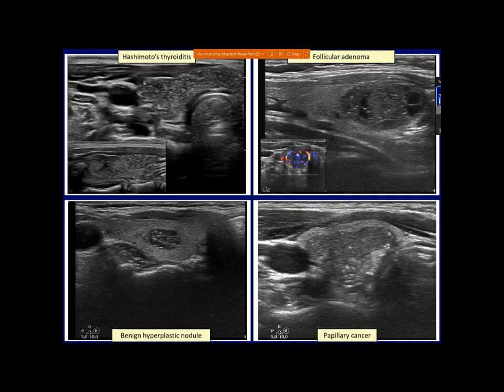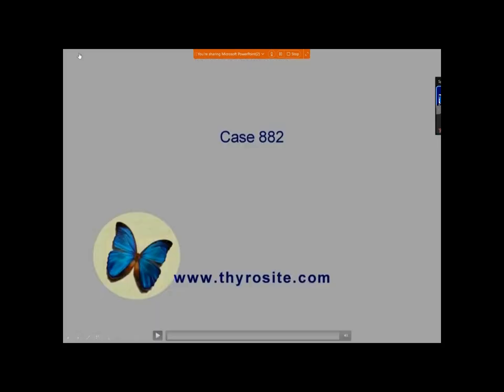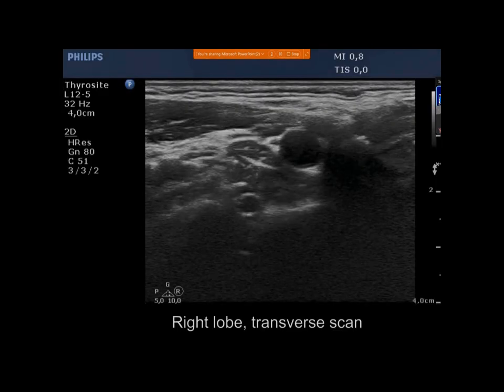So, taking all in all, we started with single echogenic spots, no clue how to interpret these granules, but when we took the environment into account, we could decide in two cases that the spots are unlikely microcalcification in that and this case. The presentation of the entire pattern stood for microcalcifications in the right lower nodule. In my opinion, the left upper nodule remained unclear. I play a video from the PowerPoint.